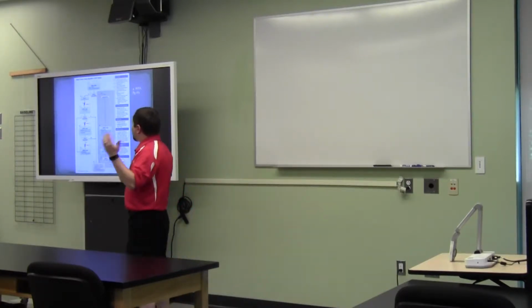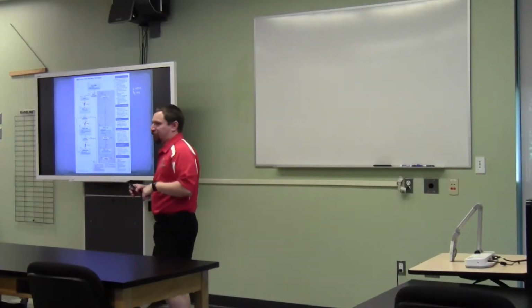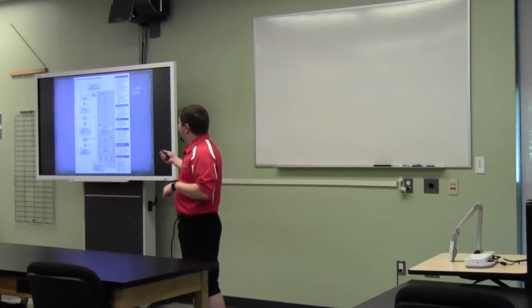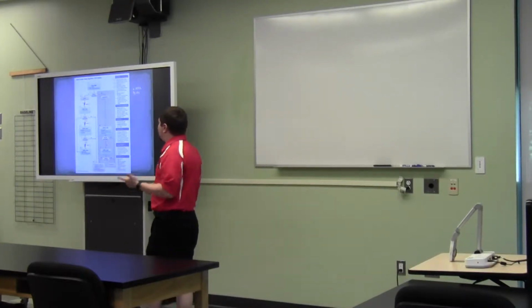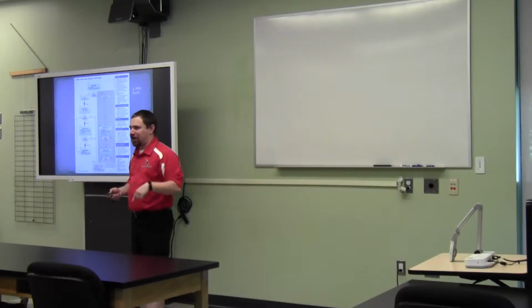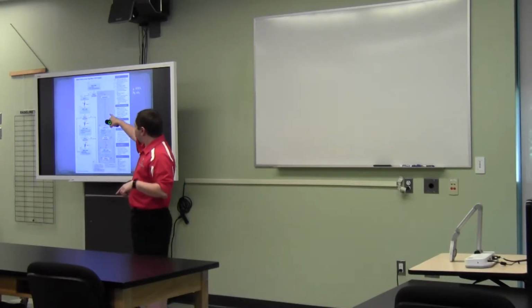So I come in, I see CPR is in progress. I'm going to verify that it still needs to be going on. Then I'm going to get oxygen involved if it isn't already, and get a monitor on. I'm going to determine: are they shockable or not shockable? If they are shockable, I'm dropping a shock.